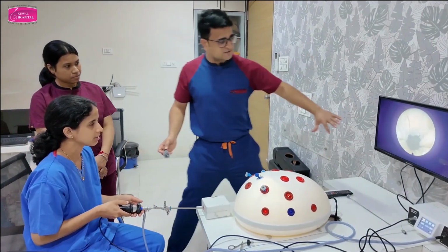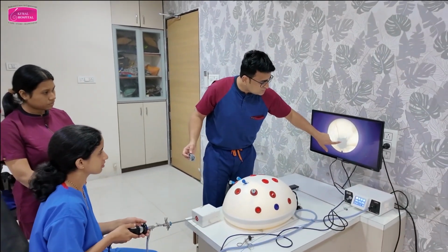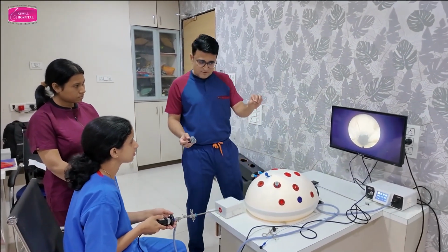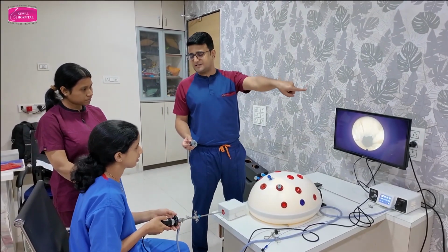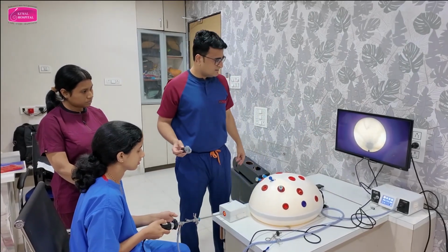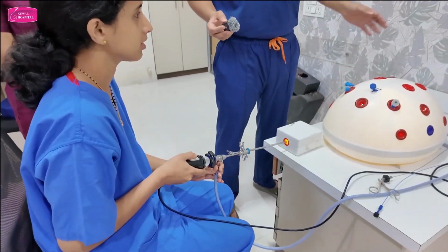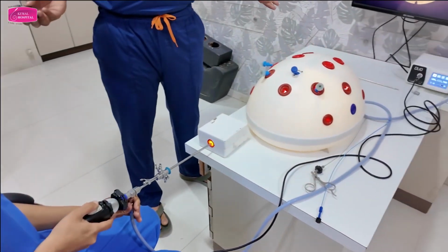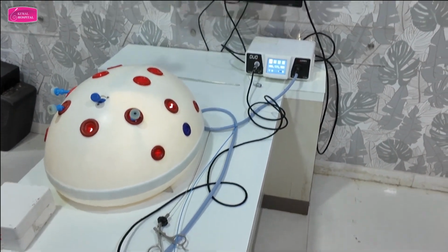Not endocervical canal. See, this whole thing is the endocervical canal. The notch you want to attach to this opening. There will be a small opening in the endocervical canal which is leading to the uterine cavity. Okay? So come back. First thing is examine the endocervical canal. There are sometimes polyps in the endocervical canal also. So if there is endocervical pathology, you have to examine the endocervical canal.